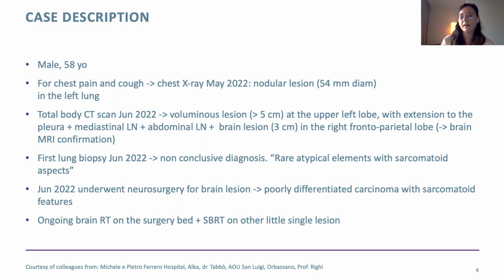So when the oncologist had the pathology report, based on the fact that there was a possibility of having a carcinoma, even with some adenocarcinoma features in the lung, at an advanced stage, he ordered actually the whole profile that you would order for a lung adenocarcinoma at an advanced stage. So the molecular profiling, including analysis of mutation for EGFR, KRAS, BRAF, HER2, and also the whole set of gene fusion that could be of interest: ALK fusion, ROS1, RET fusion, and also NTRK gene fusions.